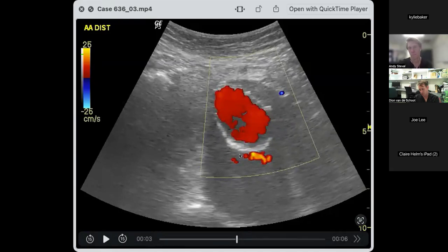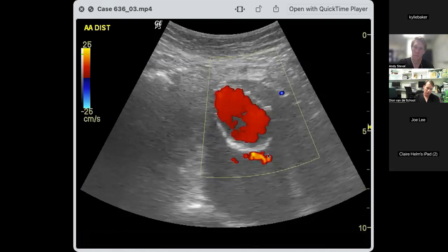Yeah. So if you come from the side and you imagine your image is going to be rotated 90 degrees and you still see color here, well, it's not a mirror artifact anymore. Definitely not, because it's got nothing to mirror off. So as you've said, you optimize your settings to make sure that you're trying to eliminate the artifacts that you can that way.